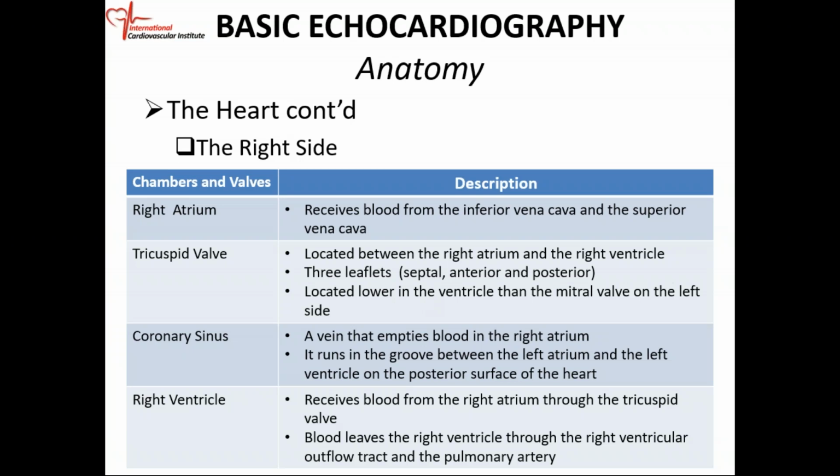But this statement is extremely important. Once you understand what the statement means, you need this statement for the rest of your echo life. Okay? Because it allows you to distinguish the left side of the heart from the right side of the heart, especially when you're doing an ultrasound scan of someone with congenital heart disease.